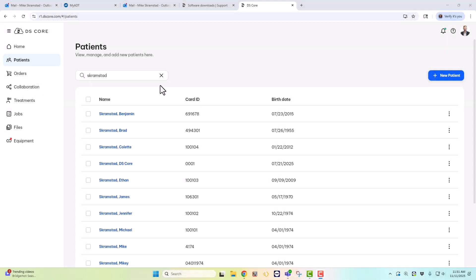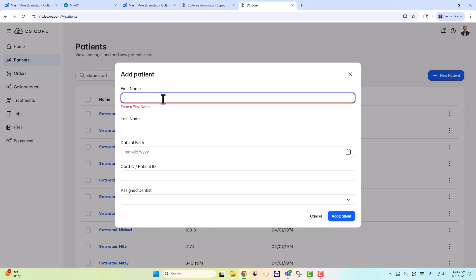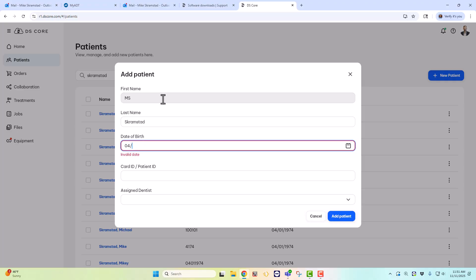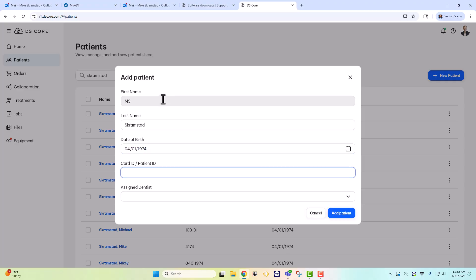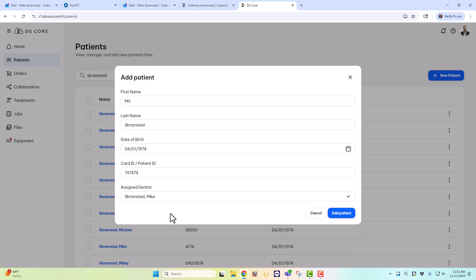Okay, so instead of creating your new patient on CEREC or the Connect software like you've been used to doing over the years, we're now going to create the patient within DS-Core. Now this is actually much easier. You can even create them before the day starts if you know what patients you're doing restorations or scans on. So once you're in DS-Core, you just go to Patients, go ahead and select New Patients, and we'll select, we'll just do Scramstead, MS, last name Scramstead, date of birth, 4-1-19-74. Create a unique ID, it can really be anything, and then assign it to the dentist if you have multiple dentists within your office, and then go ahead and add the patient.